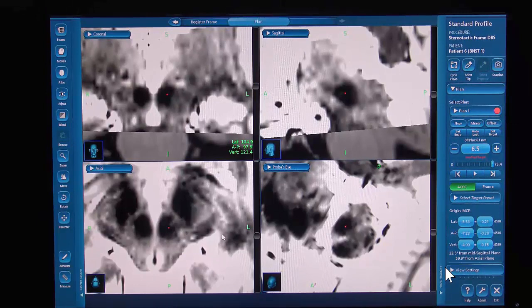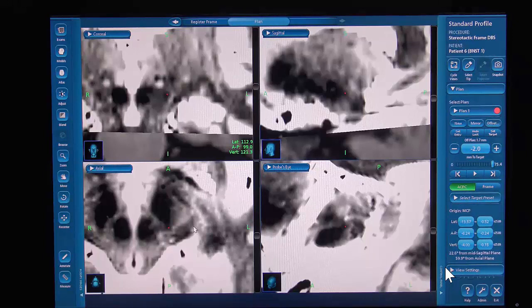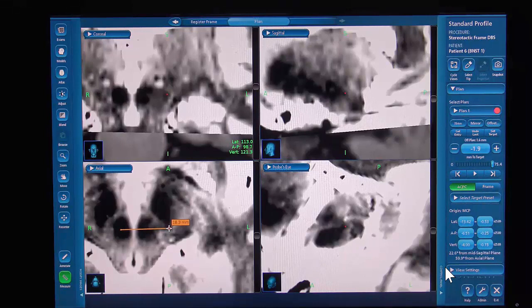We look at the center of the red nucleus, and this is located about 7 to 7.5 mm behind the MCP, and we then look at the posterior tip of the STN, which seems to be located about 1 mm more anterior. Often it's helpful to use various helplines, such as connecting the posterior tips of the STN. Or, in this case, using the center of the red nucleus. A line for the center of the red nucleus will typically touch the posterior tip of the STN or be very close.